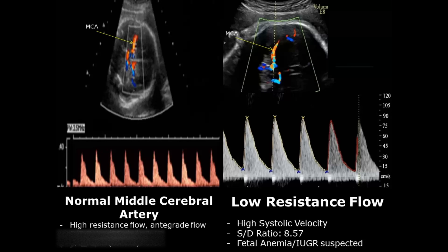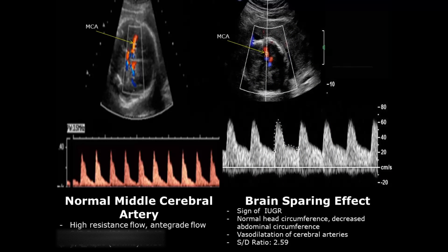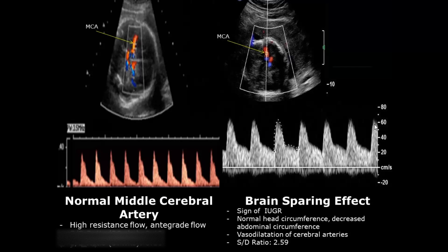The brain-sparing effect causes this low-resistance flow, which is an abnormality and a sign of fetal growth restriction. The head circumference can be normal, but the abdominal circumference is decreased. This leads to compensatory mechanisms causing vasodilatation of the cerebral arteries, producing a low-resistance flow pattern.